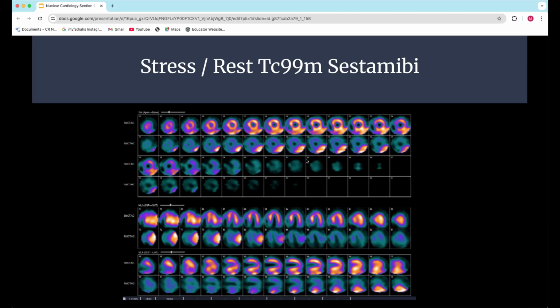Don't start the camera, don't do any CTs, but you typically have a window on your camera where you can start seeing counts, and you can set that up to where it gives you a buildup of counts, almost like an image would. Just look at it. Oftentimes, by looking at it, you can see if there's a big amount of gut that's coming up into that cardiac tissue. You can see if the liver is really, really highly perfused and it's going to cause a problem.